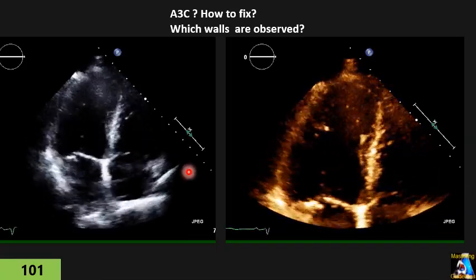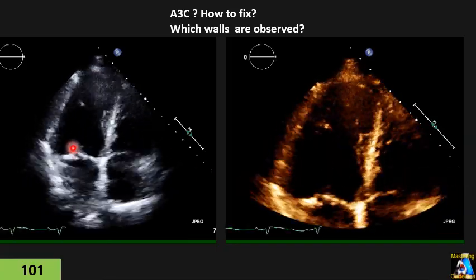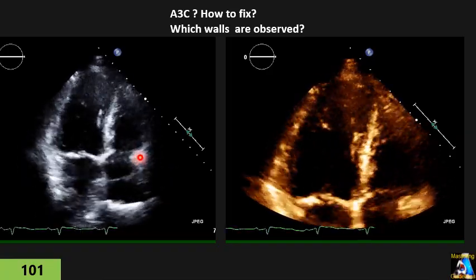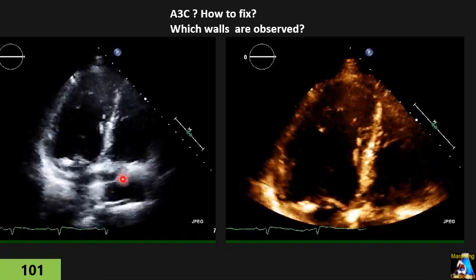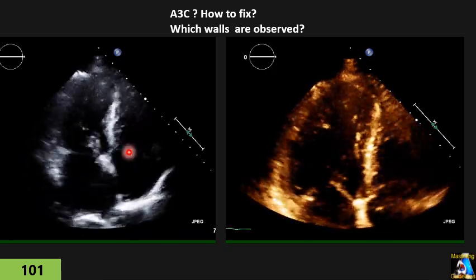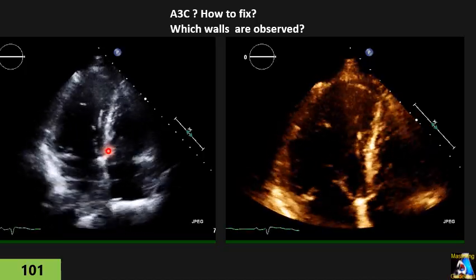Here, as you can see, it's kind of the reverse. Here is the mitral valve. It's kind of a reverse apical 4, off axis. What do I mean? If you look here, the tricuspid shows up and almost the LVOT opens too.